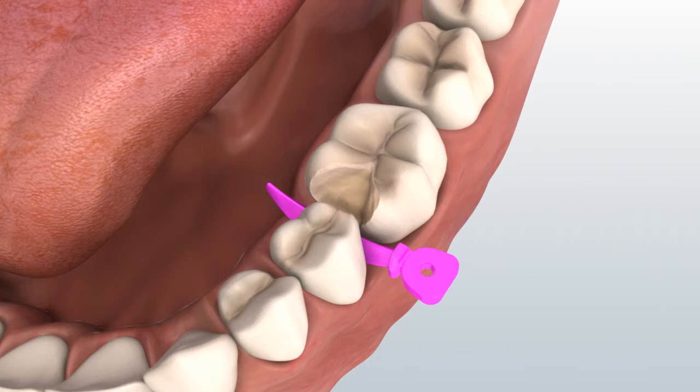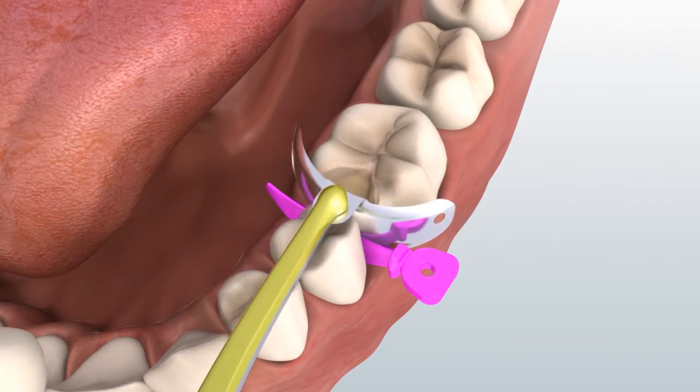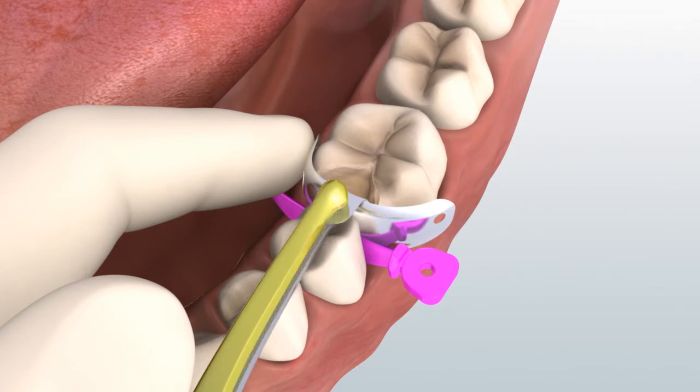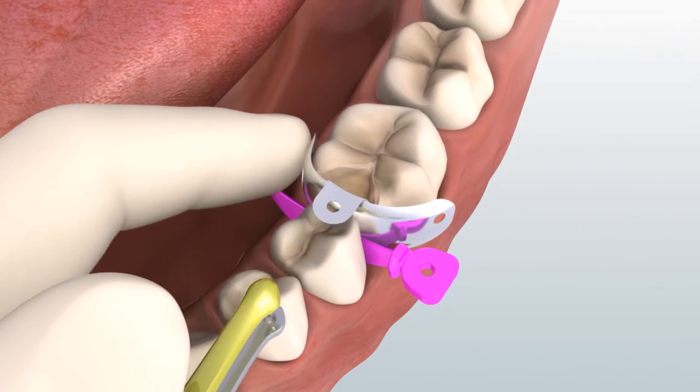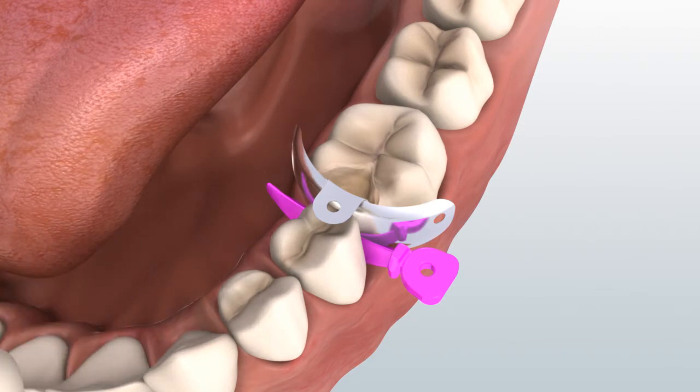Ensure that the matrix is at the right height to take advantage of the rolled marginal ridge. If the wedge is too tight for you to place the matrix, withdraw the wedge slightly while maintaining downward finger pressure on the tab of the matrix as you reinsert the wedge. If you do not wish to pre-wedge, cut the prep, place the matrix, and then the wedge.